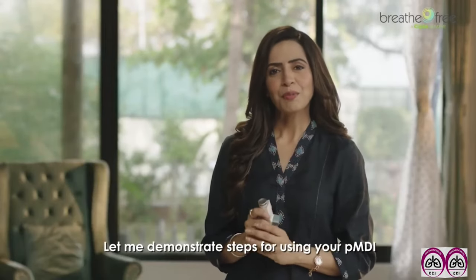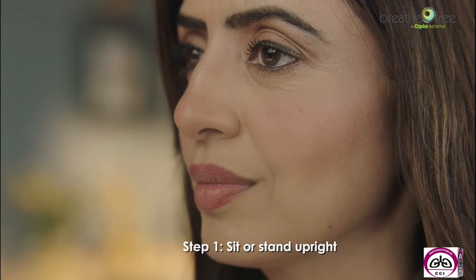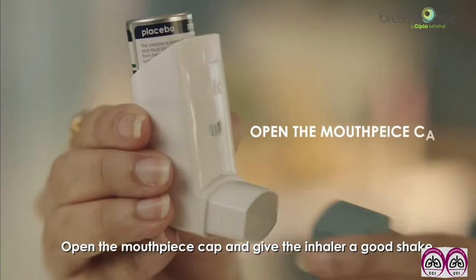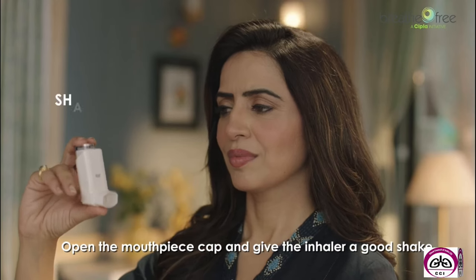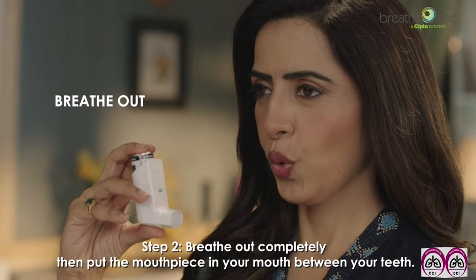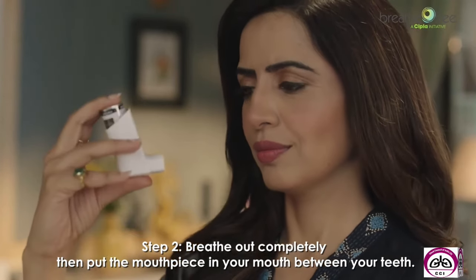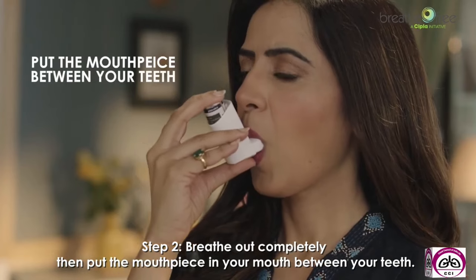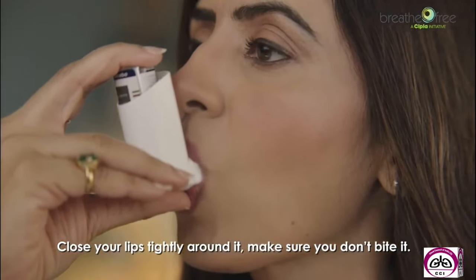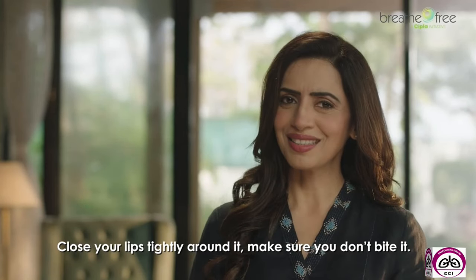Let me demonstrate steps for using PMDI. Step 1, sit or stand upright. Open the mouthpiece cap and give the inhaler a good shake. Step 2, breathe out completely. Then put the mouthpiece in your mouth between your teeth. Close your lips tightly around it. Make sure you don't bite it.